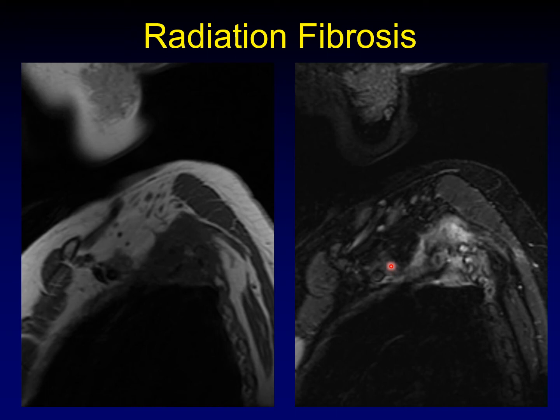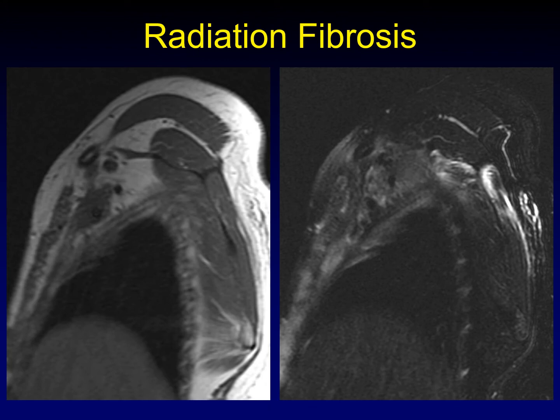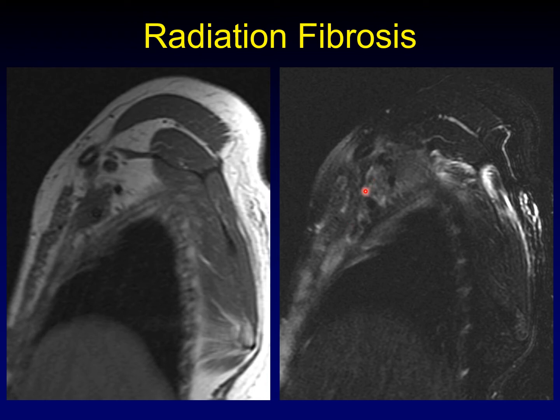So if asked what is causing a plexopathy in this patient: the brachial plexus is running right along with the artery, and this T2-dark pathology alongside the brachial plexus is radiation fibrosis. There's a big recurrent tumor here, but that's not what's affecting the brachial plexus. Another example: we're far out laterally into the arm, seeing a mass surrounding the axillary artery — very concerning appearance. Could this be recurrent tumor? On T2-weighted images, there is very low signal in this anatomic area. We use T1 to tell us where to look, and T2 signal to determine this area is not bright — this is radiation fibrosis, not recurrent tumor.